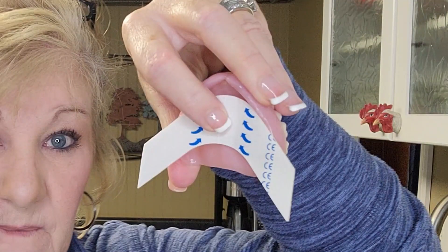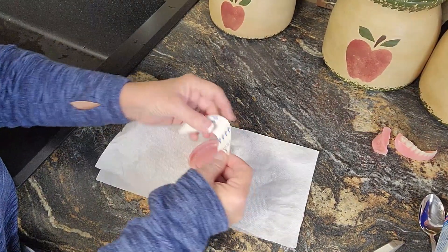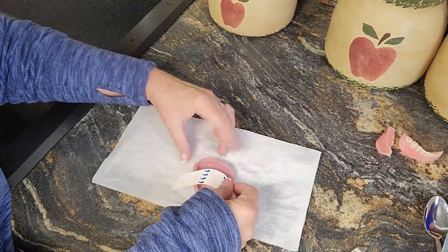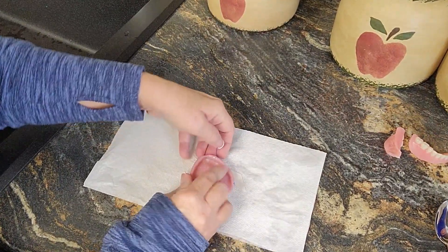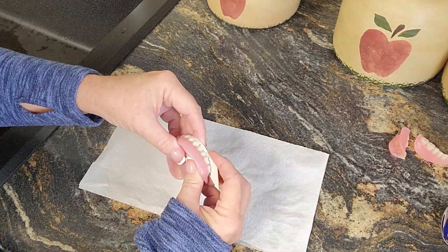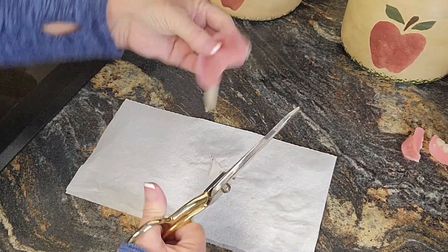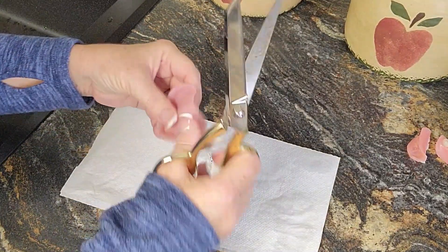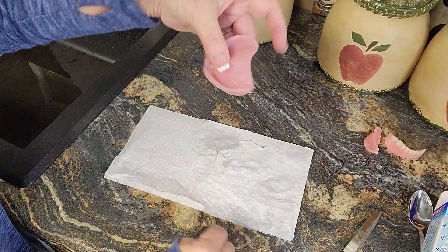These are made for the lower, don't forget that. We may have to cut them down to size to get them to fit — it's awfully big. Let's see if we can make this work. Oh, there we go — that might be easier to get it to fit. I'm going to trim this off on both sides. Oh, that works — look at that, that works so much easier.